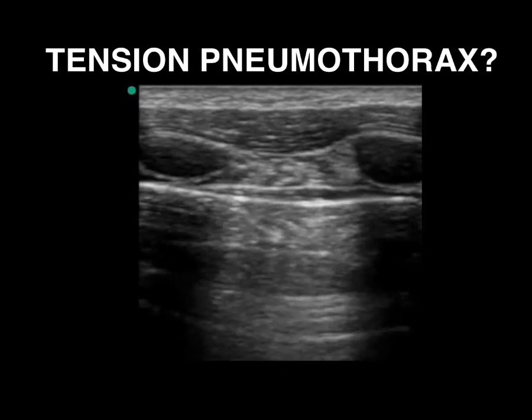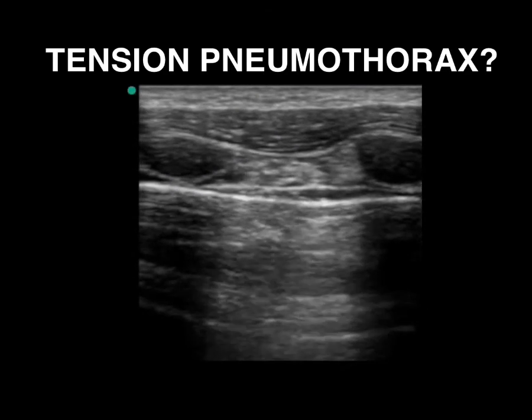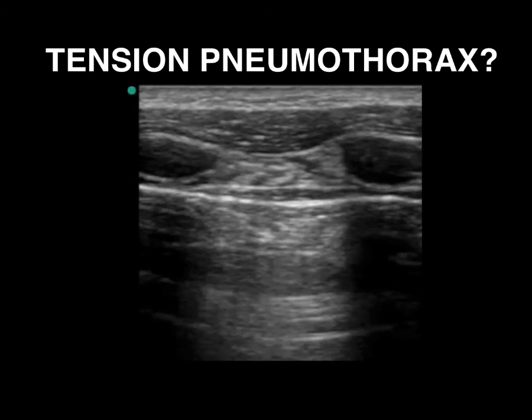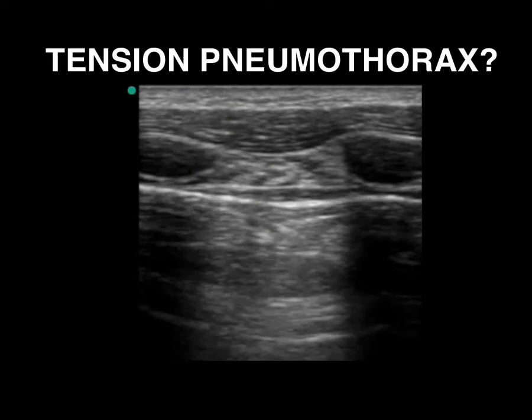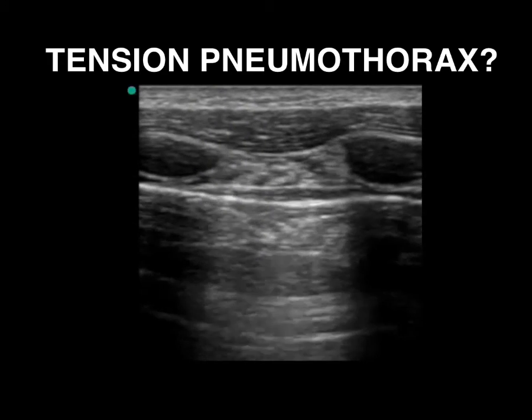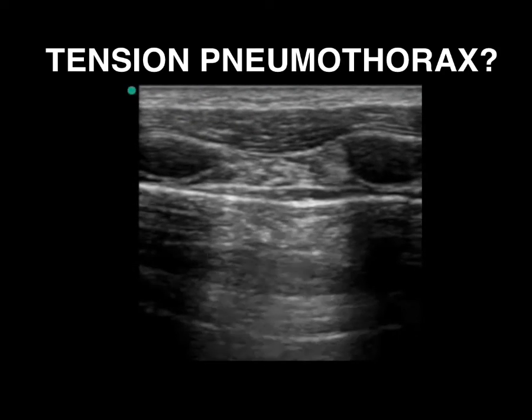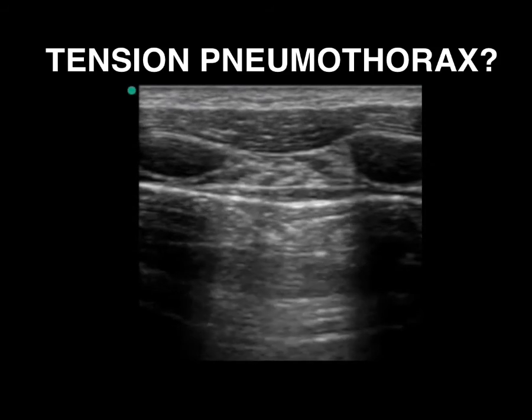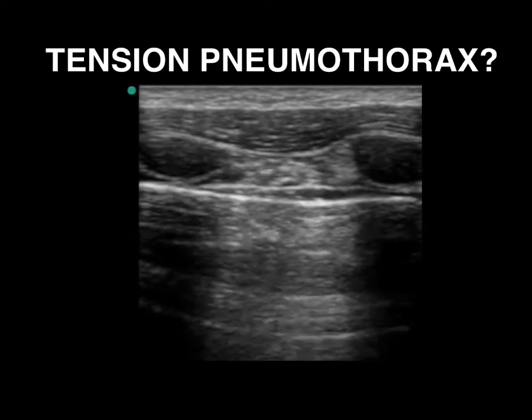How about tension pneumothorax? Any data? Not really. We have no idea what the frequency is, because most of the studies have been performed looking at the heart, with echocardiography. They haven't really looked at the lungs. But it makes sense, right? It's a form of obstructive shock that we know will lead into PEA. There are plenty of case reports. We know how to treat it, an easy intervention, especially if it happens in someone young. This might be a totally reversible problem.